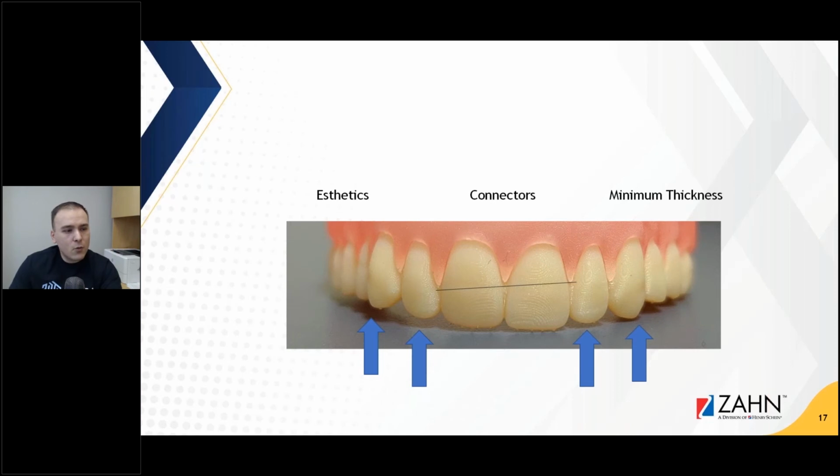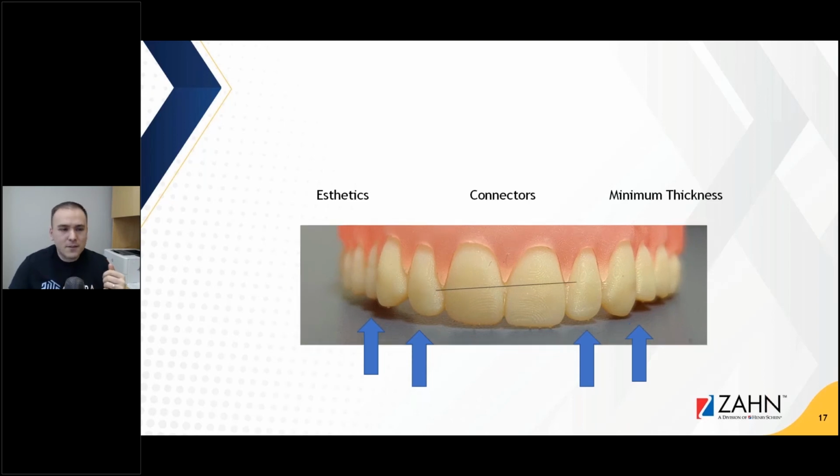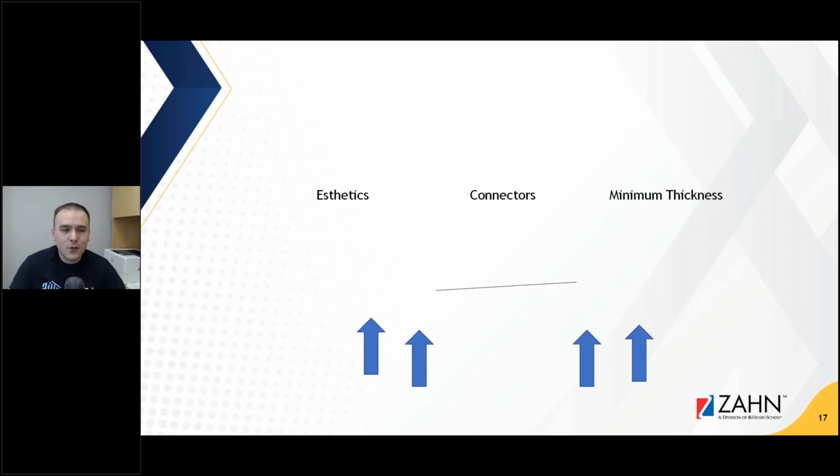And so everything was manufactured great, but now that we start to really pay close attention to that 6 to 11 aspect, we see that the contour is completely rolled in, especially when compared to the buccal corridor of the posterior teeth. And then we have the interdental papilla that are really not on the same level, so it's not going to look uniform and great. And so at the end of the day, we decide we can't really use that either. So we just wasted all this time manufacturing things that weren't designed correctly.